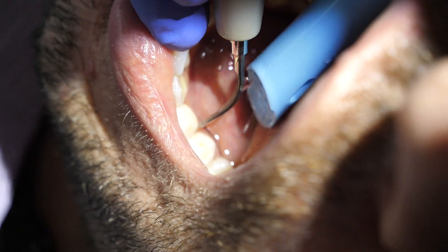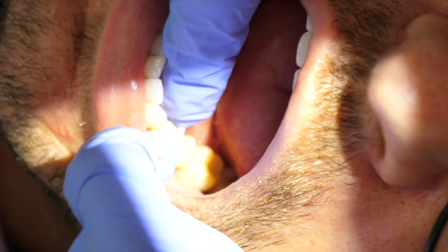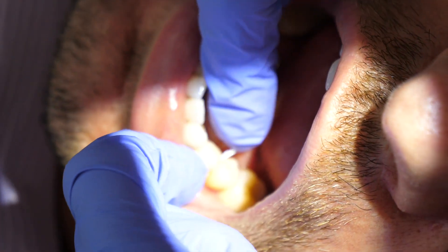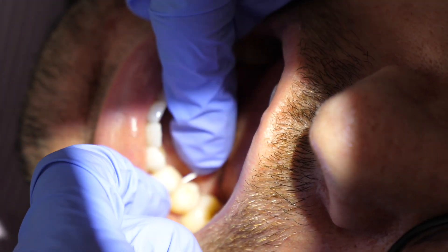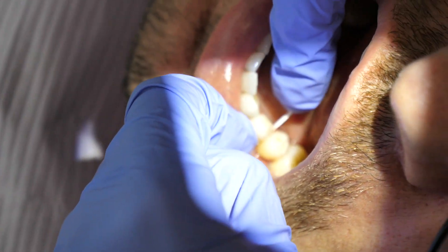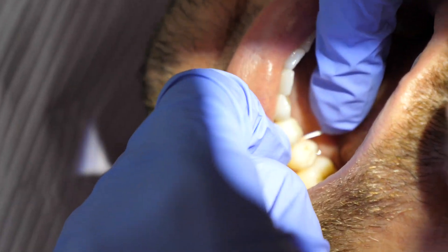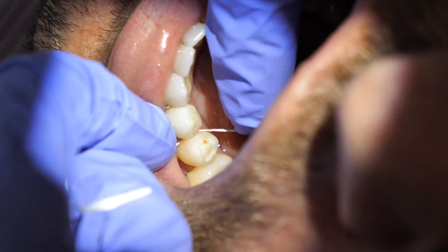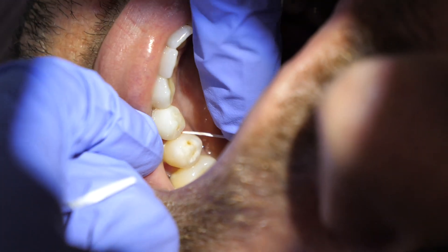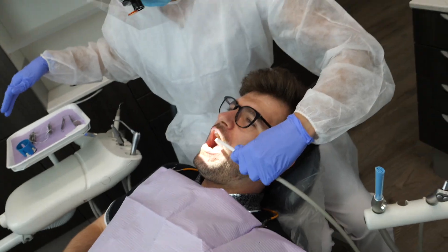That's how I finish, but then lastly I check it. I check it with floss first. With floss you can really wrap it around the tooth to feel if it's smooth or not. If you happen to feel a little bump — maybe a grainy piece of tartar or a little clickable piece — if you feel that it's there, it can sometimes be hard to detect exactly where it came from with just floss.